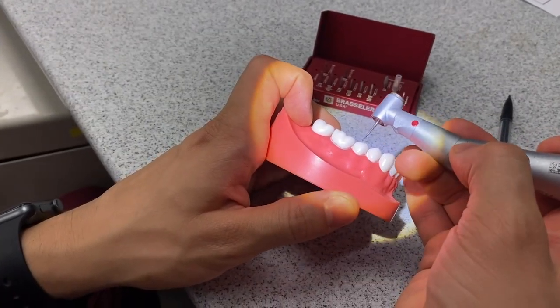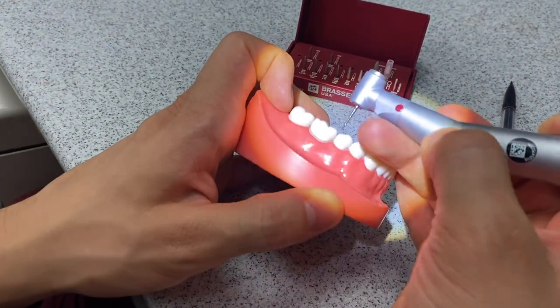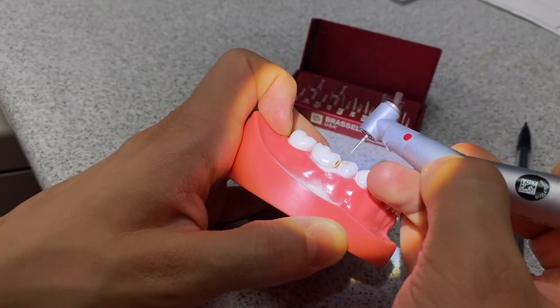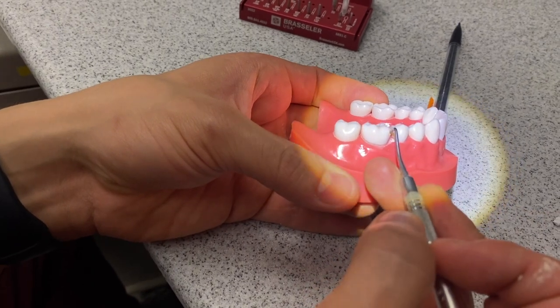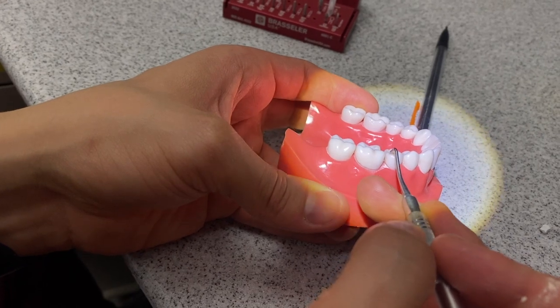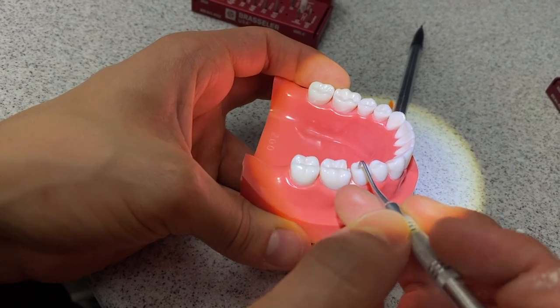Okay guys, this is the first step. The first step is interproximal breakthrough. For this I'm going to be using the flame burr — you can also use the 169L. I personally prefer the flame. As you can see, I've done my interproximal breakthrough, but I have left a little enamel shell that I'm going to go in with an instrument and just flick off. Now I know for a fact that the adjacent side of my adjacent tooth is intact — I have definitely not nicked it. That is one big tip: leave that little shell to protect the adjacent tooth.